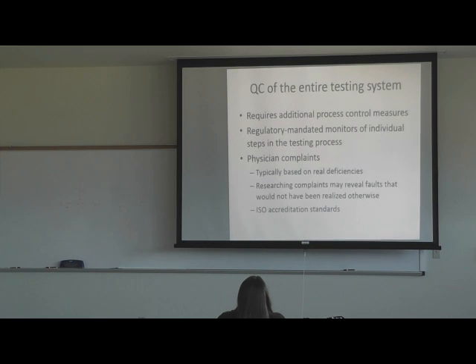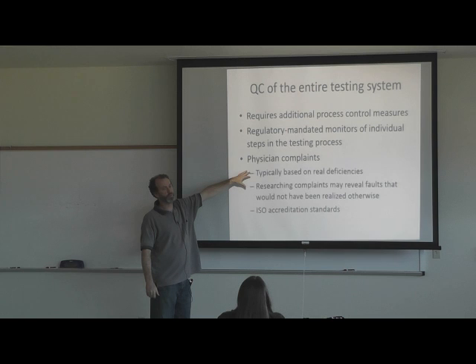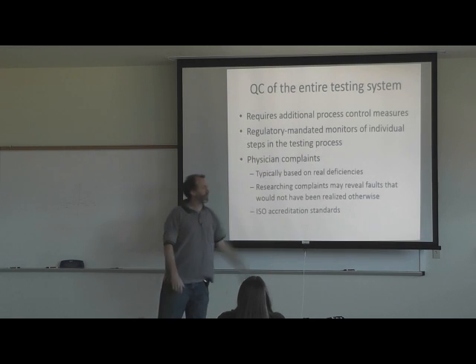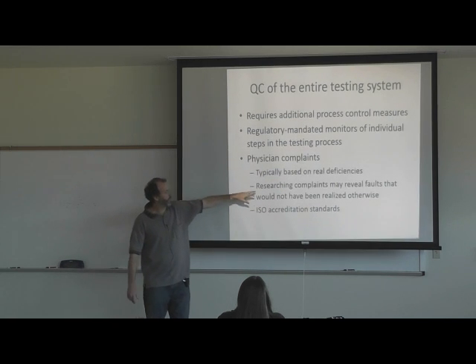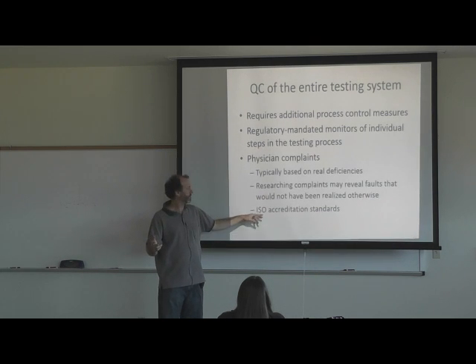So, QC of the entire testing system requires additional process control measures, with regulatory mandated monitors of individual steps in the testing process. Your book mentions physician complaints. They shouldn't just be blown off. All those doctors just always complaining, right? But complaints can typically be based on real deficiencies. Researching complaints may reveal faults that wouldn't have been realized otherwise.